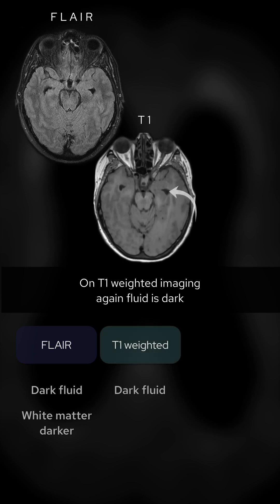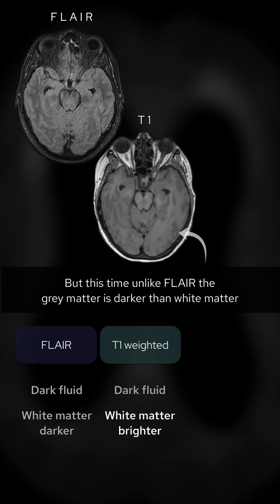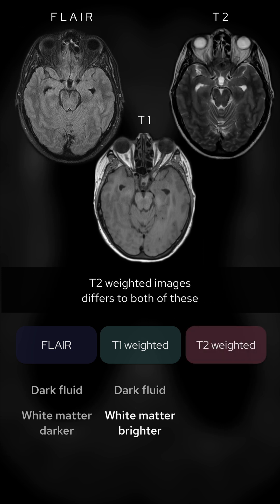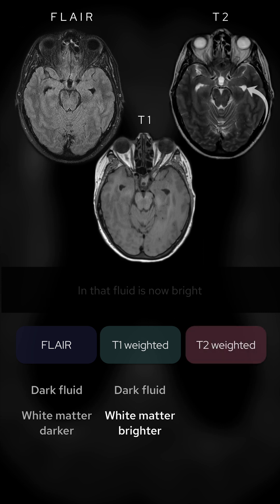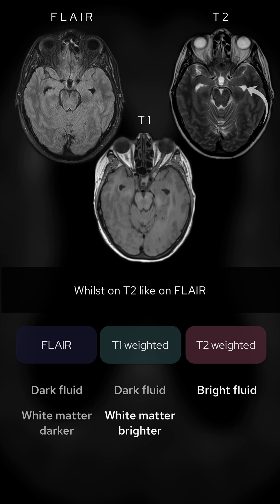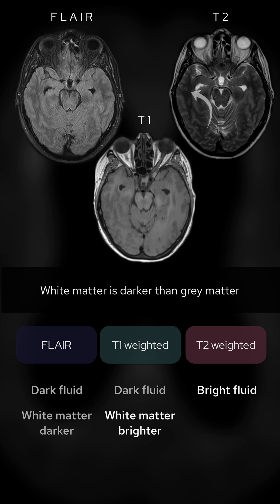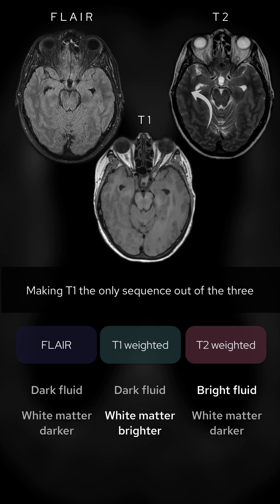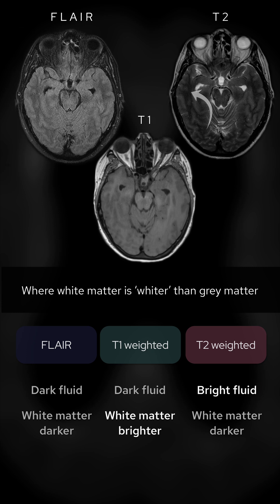On T1-weighted imaging, again fluid is dark, but unlike FLAIR, the grey matter is darker than white matter. T2-weighted images differ from both in that fluid is now bright. Whilst on T2, like on FLAIR, white matter is darker than grey matter — making T1 the only sequence of the three where white matter is whiter than grey matter.